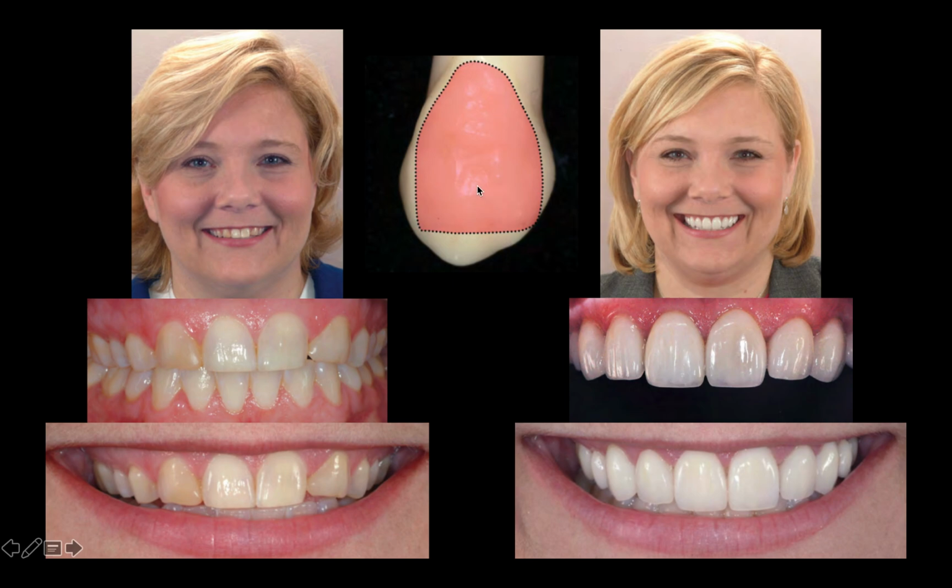And the authors included this picture to show this is your average canine here, and then this orange is your average outline for a lateral incisor, right? So these two right here in the lateral incisor position are actually canines. These are the patient's canines, and these are the patient's first premolars, and so on and so forth. And if you look at it, I think it looks extremely natural. I mean, they weren't able to completely correct the midline, but when you look at before and after, this is something that we really hope to see our patient look like in the next couple of years, and have just a great result with that.